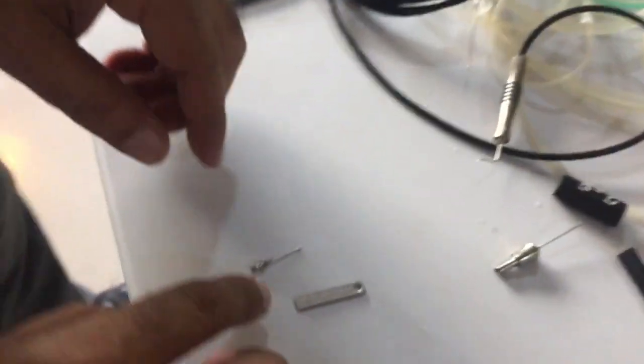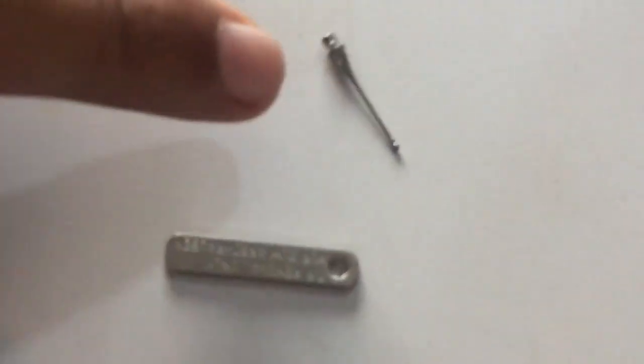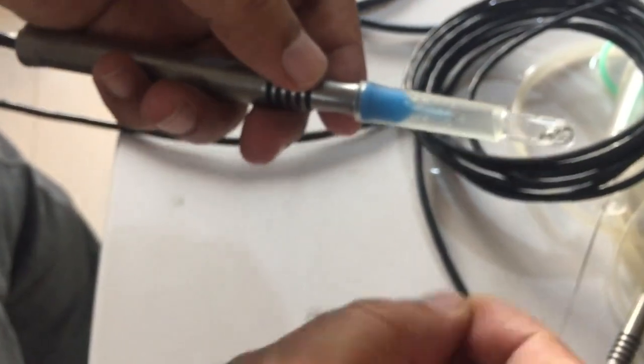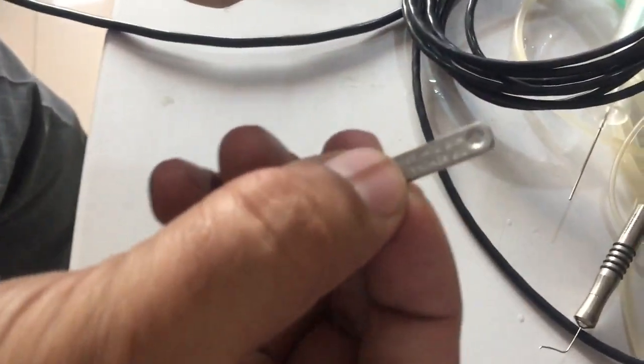Here is one other type of tip. This is the disposable tip. This is the disposable key. If you want to use this disposable tip, you can mount this tip on the handpiece by this key only. So thank you very much for your understanding.